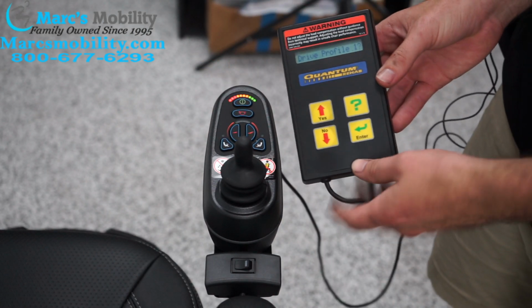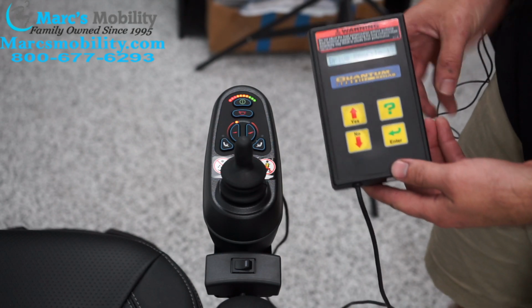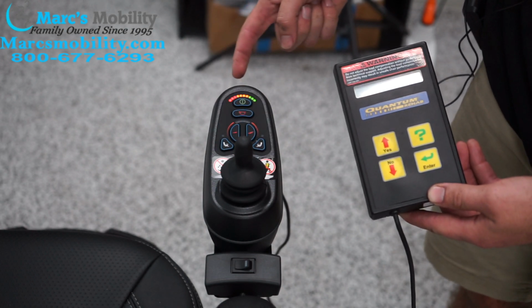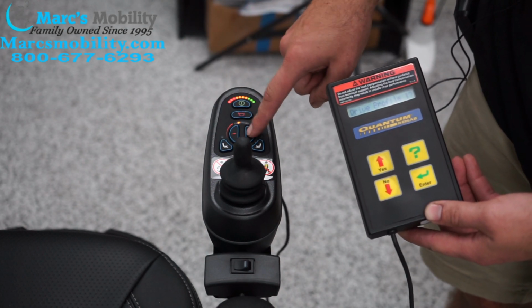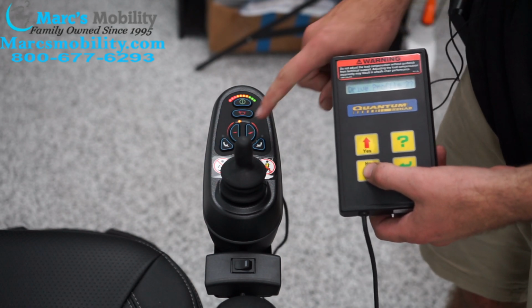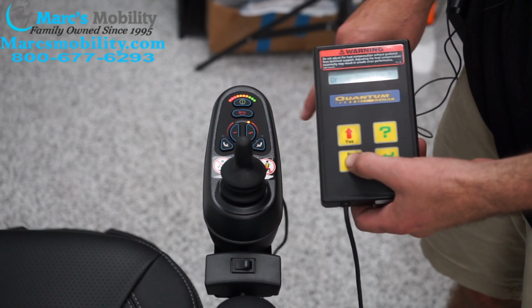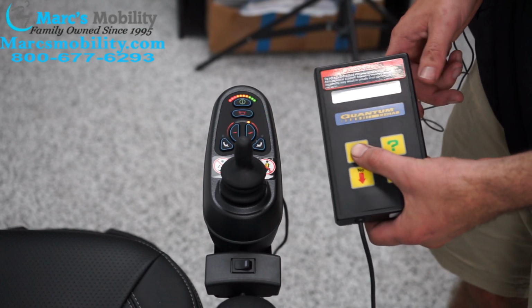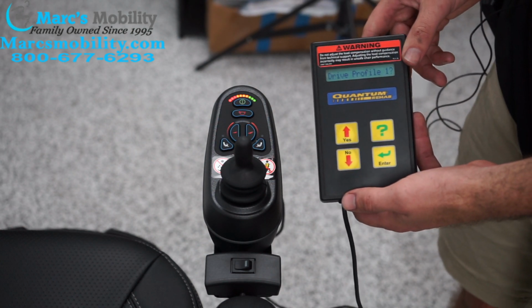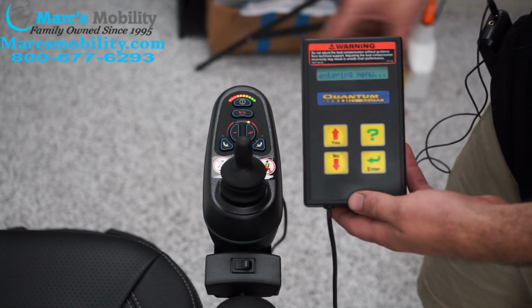So we start, the very first thing you'll see is it'll say drive profile 1. Now that is referring to the speed on the joystick. So I'm on the lowest speed, which is profile 1. This is drive profile 2. If I hit down, I can edit this speed. I can edit 3, 4, or 5. So I'm going to start with 1. And there's other options on here we'll get to later in the video. So I'm going to start editing drive profile 1. I hit enter to edit profile 1.